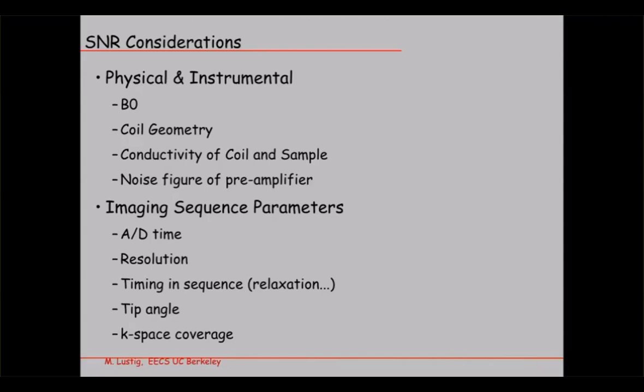And then we have a whole chain of coil to amplifiers and digitization, and they all have what's called a noise figure, like how much noise is being injected into the system, and that is also affecting your signal to noise ratio. Could affect. Now, in a well-designed system, you try to have that be the least affecting, such that it's negligible, and we'll talk about that a little bit more. So these are the physical and instrumental sources of noise and where they can come from.